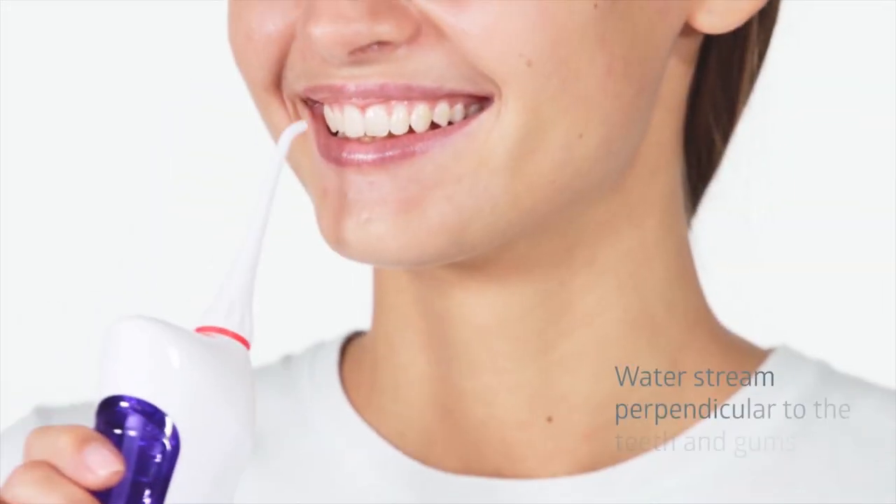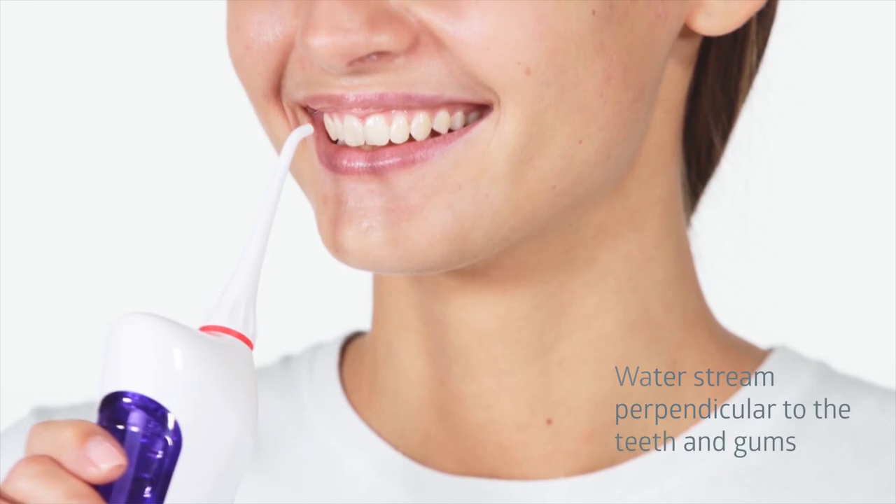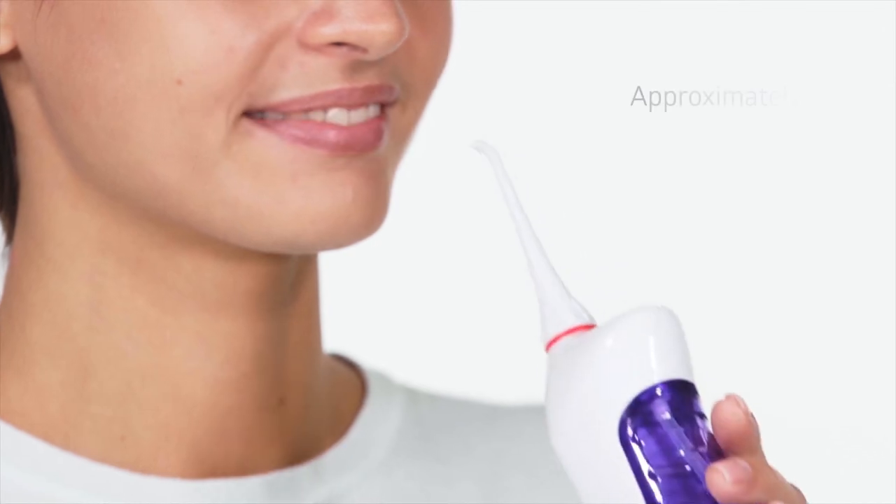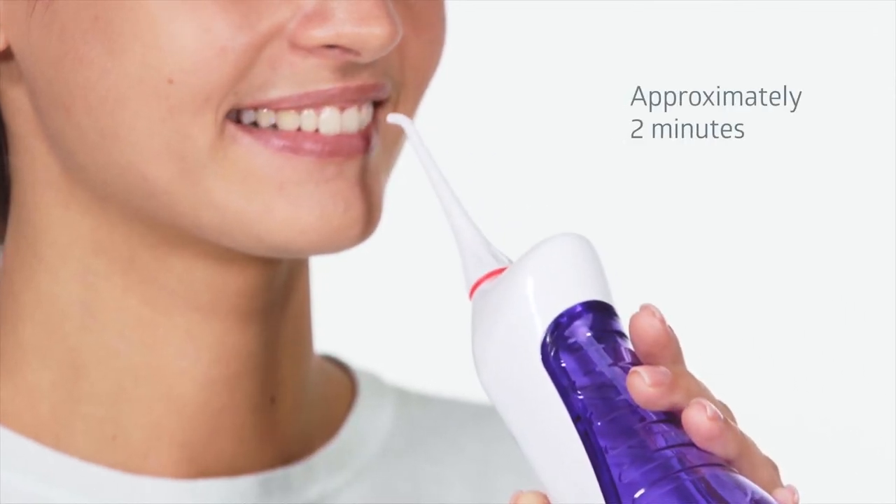Clean your teeth correctly. Try to direct the stream perpendicularly to the teeth and gums. Do not press the nozzle against the teeth and gums to avoid excessive stream pressure. Clean the entire mouth cavity thoroughly. The average cycle takes approximately two minutes.